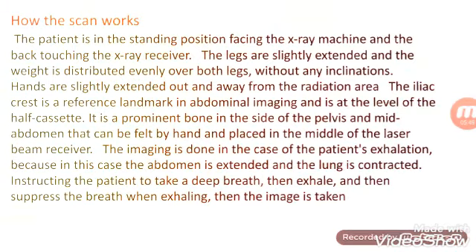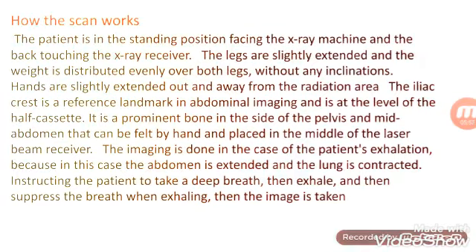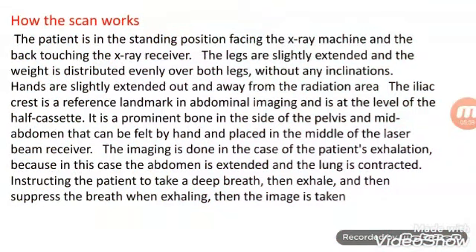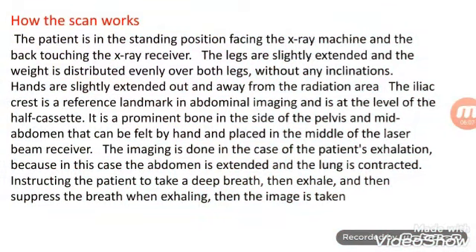The imaging is done in the case of patient exhalation, because in this case the abdomen is extended and the lung is contracted. Instruct the patient to take a deep breath, then exhale and then suppress the breath while exhaling, then the imaging is taken.